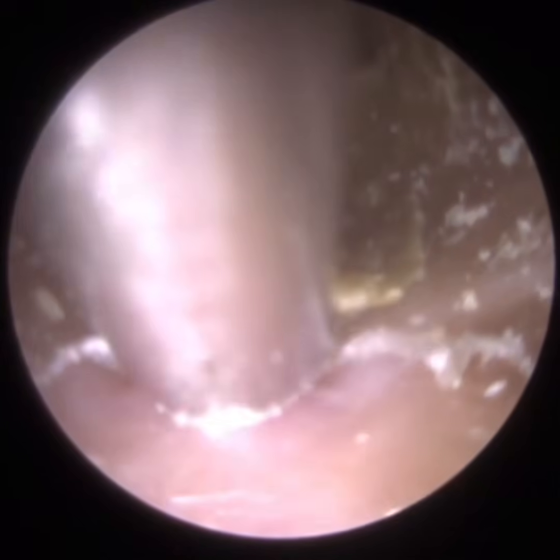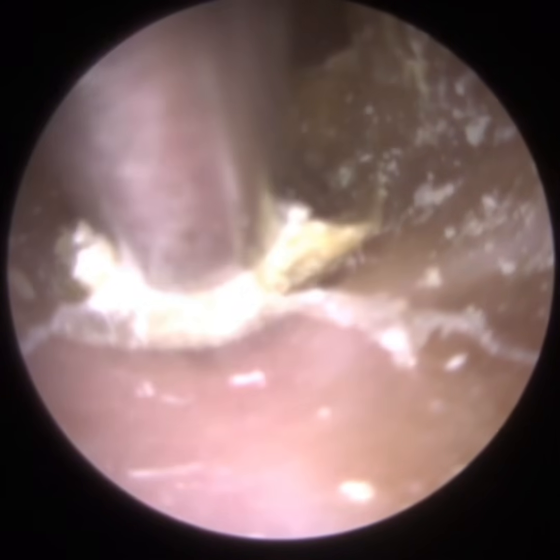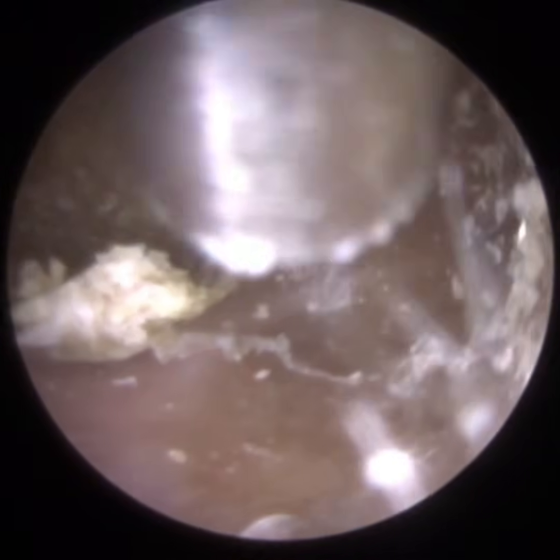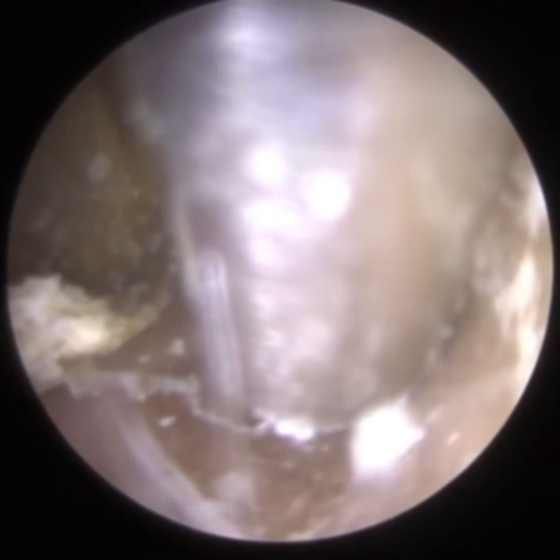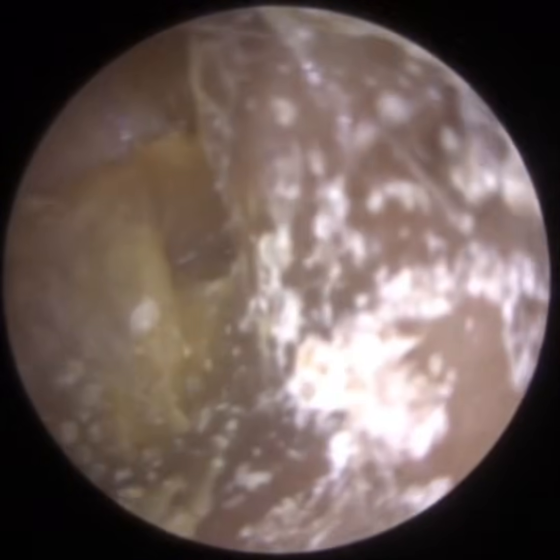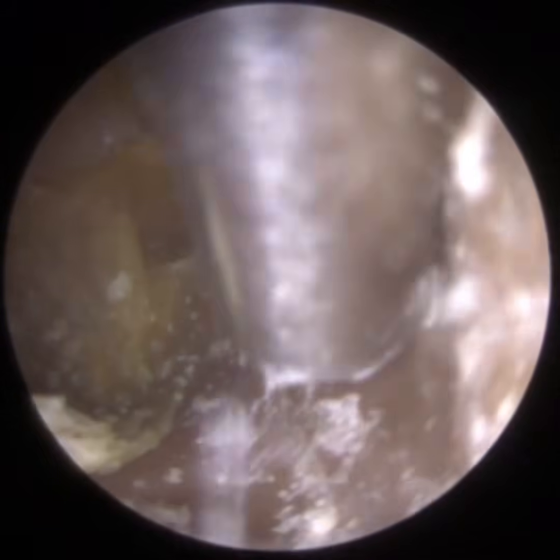Now, you could be forgiven for believing that this skin has got some fungal infection because you can see some spores, but that's not the case. The patient regularly uses an antibiotic spray, and what the antibiotic spray does is almost crystallize the skin, so it prevents it from getting infected, wet and sticky. If you wait till the left ear, the second ear, unfortunately the patient hadn't been using the spray in that ear, and it caused the skin to get infected and damp. So you'll see the contrast.